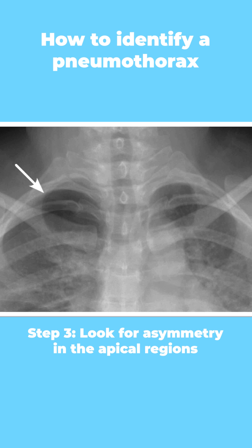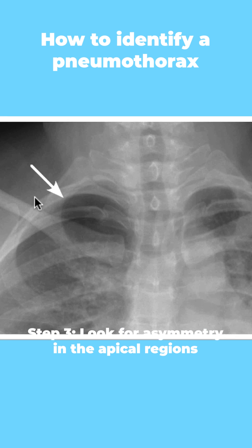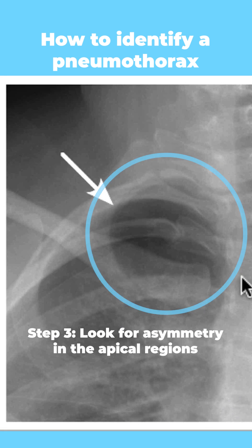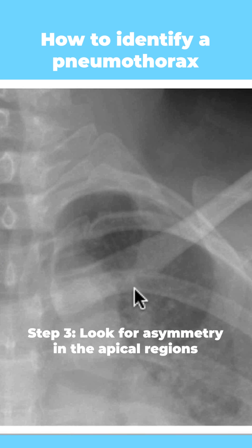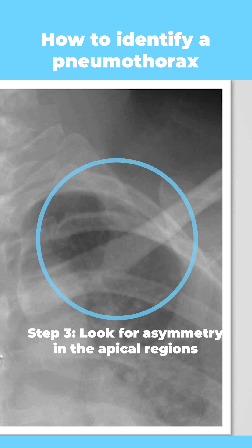Next, we look for asymmetry in the apical regions, knowing that the pneumothorax — or the air within the pleural space — will rise to the highest point. In this case, we can identify that the right apical region is blacker than on the left.